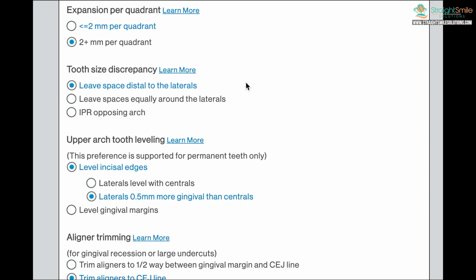Followed by, well, of course, wisdom teeth, but we don't care about those. Followed by premolars. They can be funky shapes, sometimes funky sizes, and they don't fit together right. So sometimes you don't know. I mean, obviously, I can look at a case now, and for the most part, I can predict a tooth size discrepancy, even a minor one, on the front end, and I feel pretty confident, like, oh, just by the way, your laterals are a little smaller than they're meant to be. So I know that it's not going to fit together ideally if we try to close the spaces.